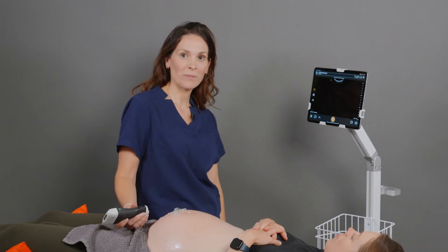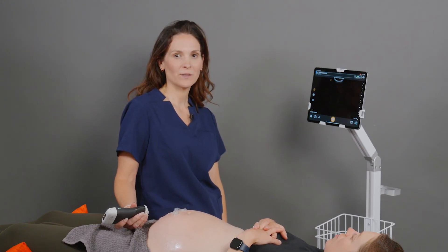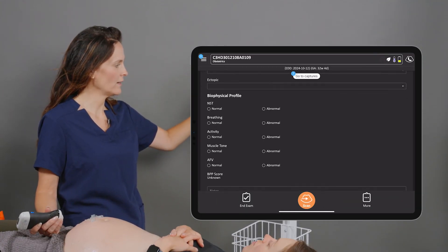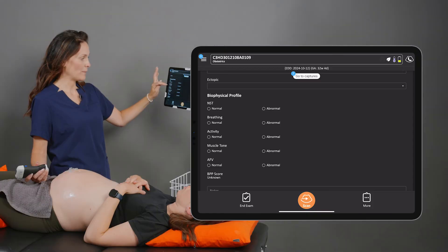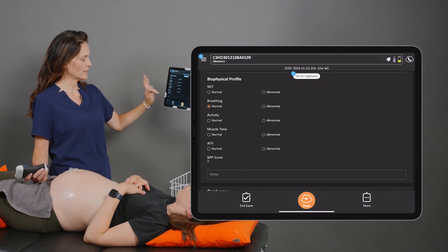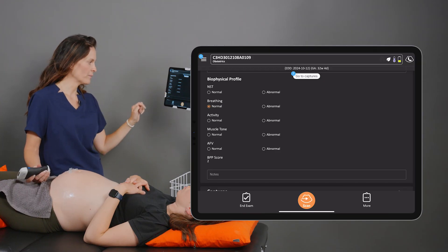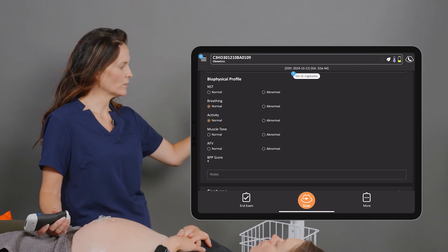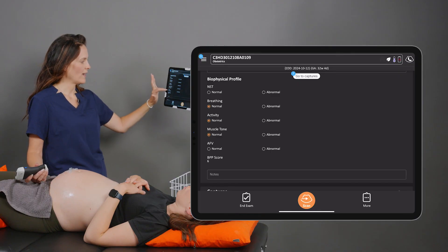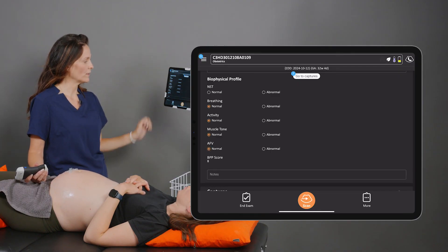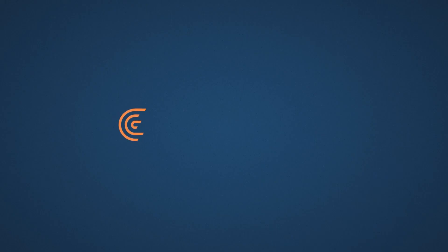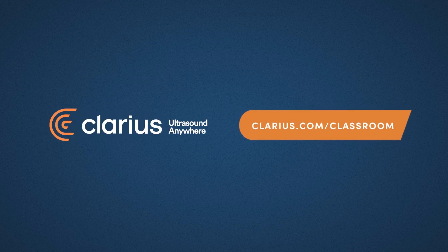Once I'm satisfied that the baby has demonstrated all four components, we head back to the patient demographics page for the scoring. We demonstrated the baby's breathing — we'll give it a normal score and it automatically adds the total at the bottom. Fetal activity is normal, so it adds two on. Muscle tone is normal, so another two, putting us at six. The amniotic fluid volume was also normal, so this baby has scored eight out of eight for the biophysical profile scan. Take care, bye-bye.